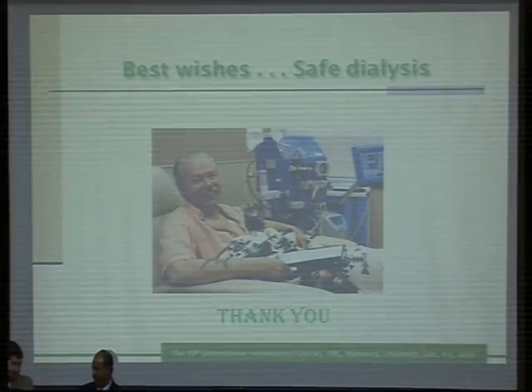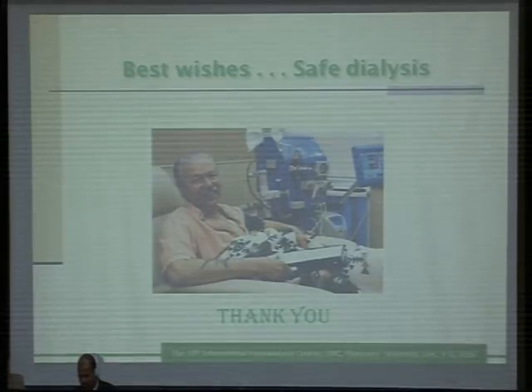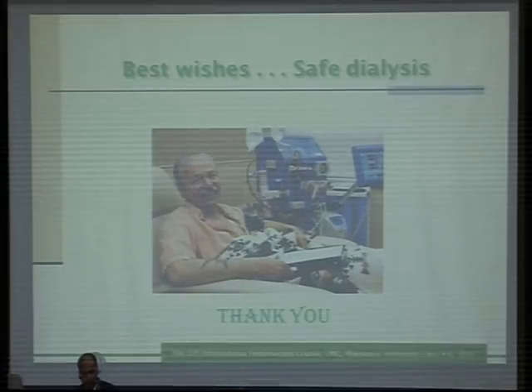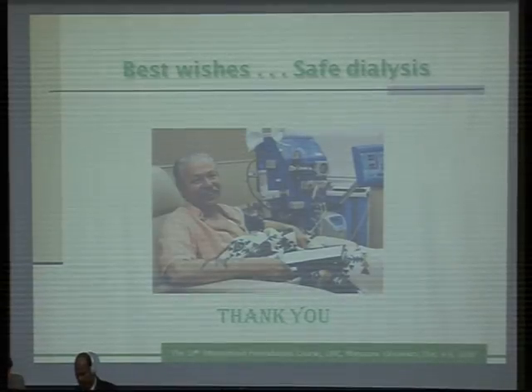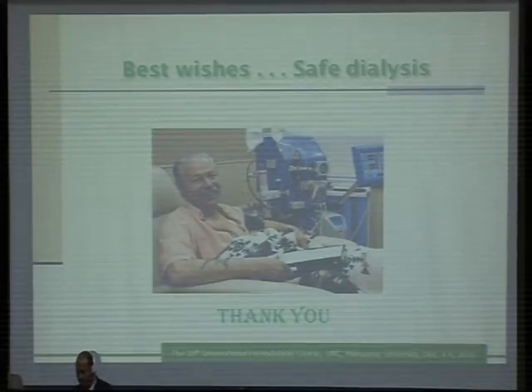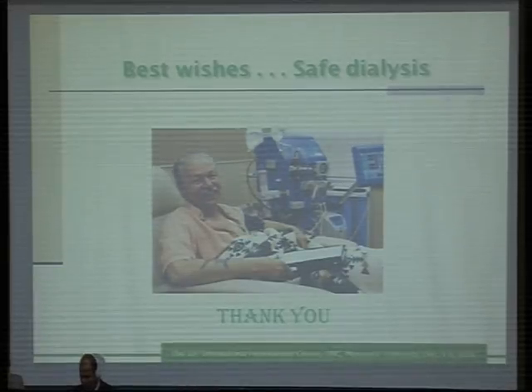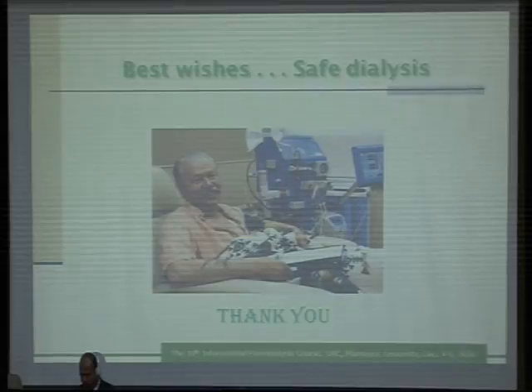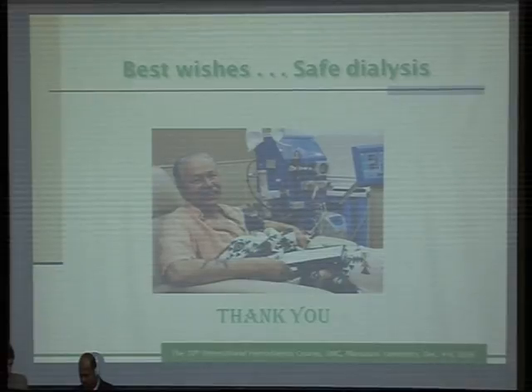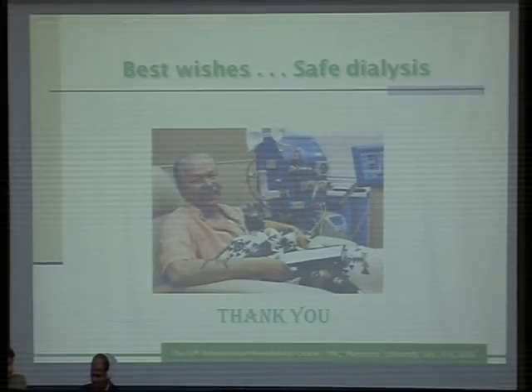So you see that these cases were due to the unattended decisions by the physician, or due to needle dislodgement, due to covering the fistula site, and the other one, the cut of the electricity and the machine was stopped. This is why we mentioned that we should have planned and regular checking of the machine, with the instructions of the machine.